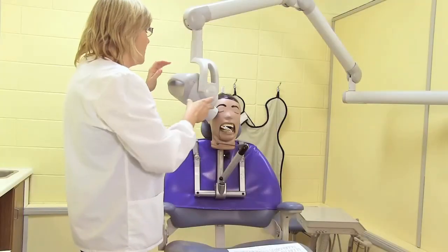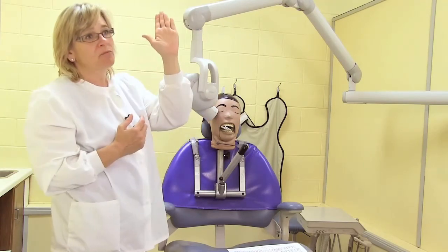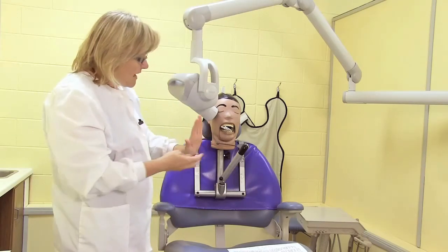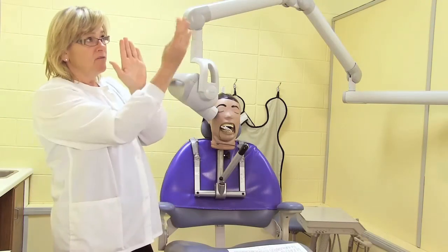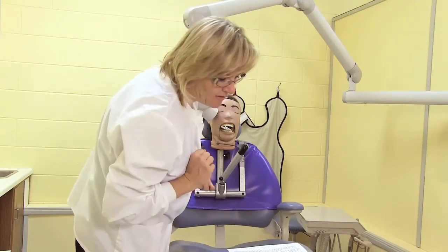But again, we know our Dexter here has a shallow palate, so I'm looking at increasing the vertical angulation. Let's say his palate was vaulted and higher up. Then the film would actually be probably straighter, and because it is flatter against the teeth, we would have to decrease instead of increase the vertical angulation.